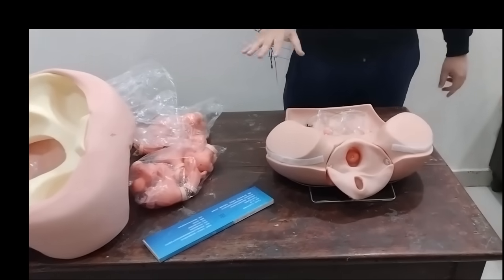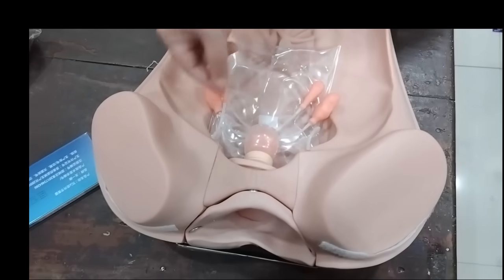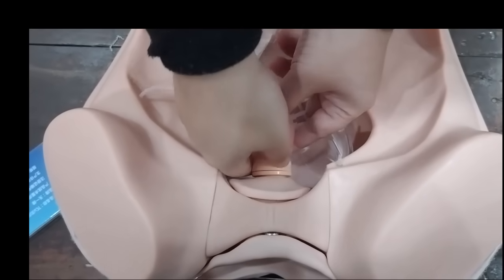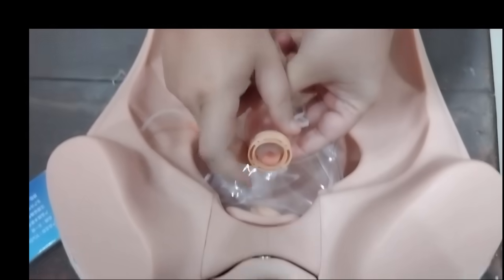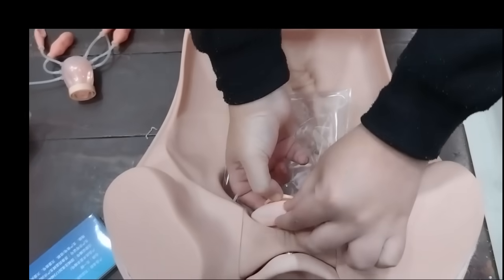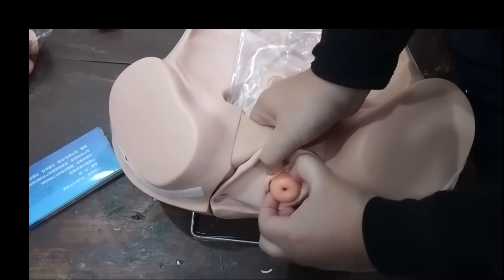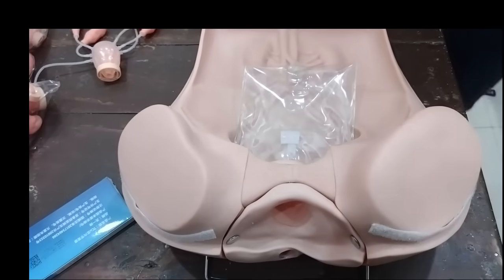So this is how you remove it from the inside. If you wish to change the uterus that comes attached with the model, all you need to do is detach the tubings, hold the uterus, and rotate this ring counterclockwise — and here it comes off. If you wish to remove the cervix as well, you need to just hold it, do the same with this ring, and you can take it out through the vagina.